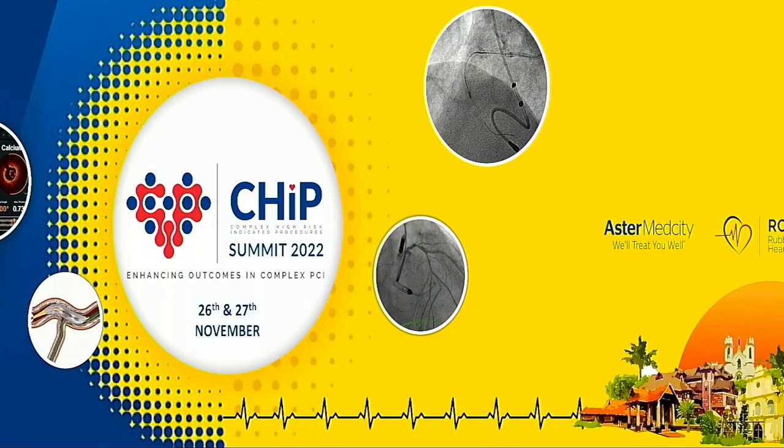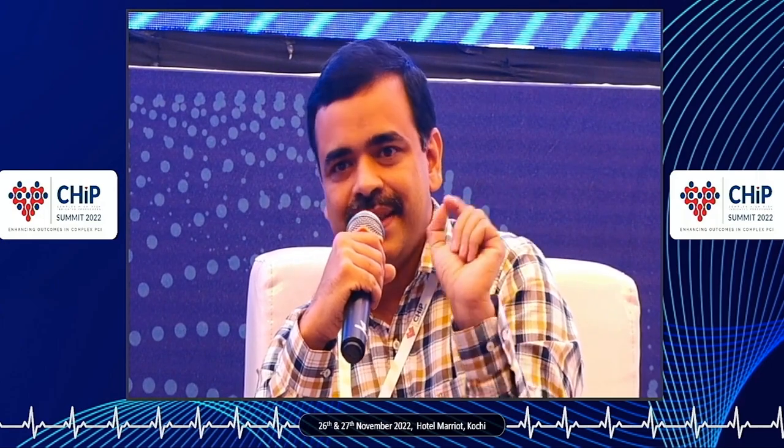I have the same disclaimer as Deepak sir, no direct experience. But my understanding is laser has been around for some 30 years now. Despite Samir Sharma sir presenting yesterday, even now in the US, the penetration is 1 to 2% of total calcific lesion therapy. So the subset I could find was, one, when the lesion is not crossed. Even then the laser need only sit on the lesion, not cross. In such a situation, this will work. Second, like an underexpanded stent. Like IVL, this does not damage the stent. So underexpanded stent is another one.